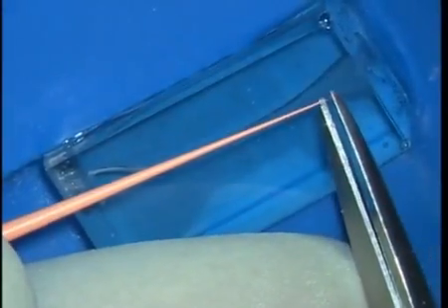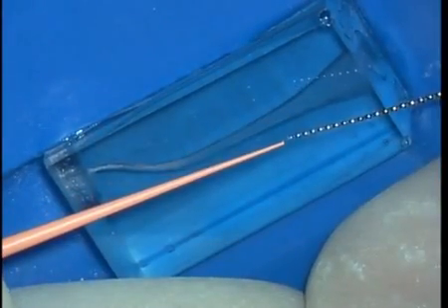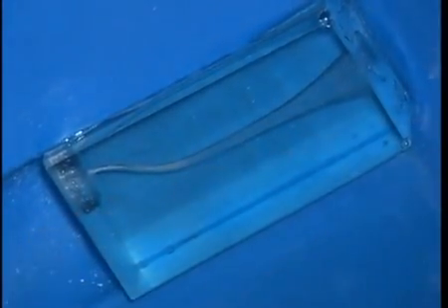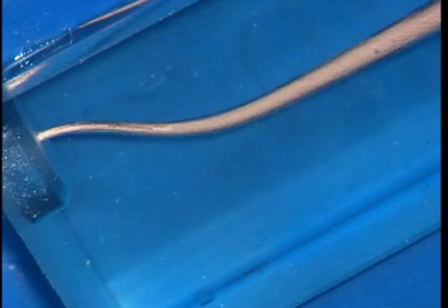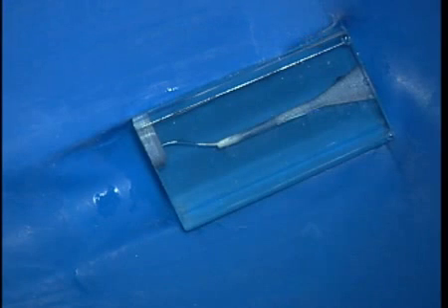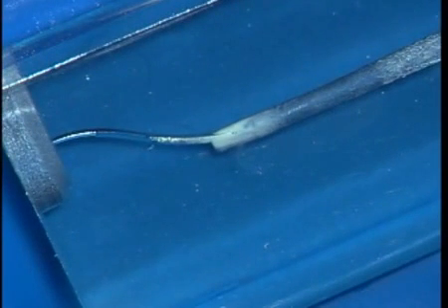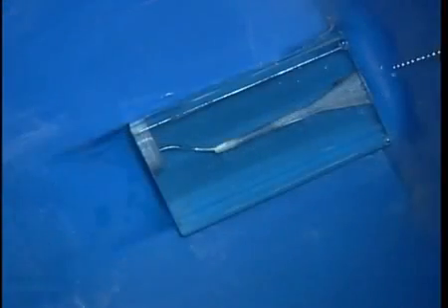A medium, non-standardized master cone is selected and trimmed so that its apical diameter matches the last file that was snug at length. The cone is fit in a fluid-filled canal. Following Type 1 ledge management, notice how easily and freely the master cone slides to length. Let's look at how to manage a Type 2 ledge. Again, we have the block with the S-curved canal. Notice that there's more debris in this block than there was in the previous case we just managed.